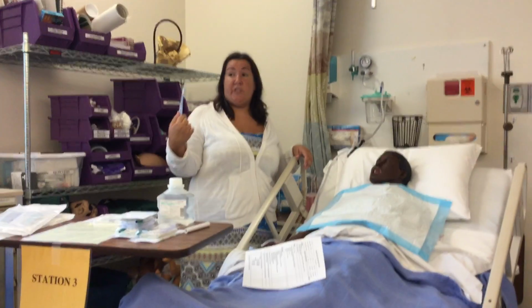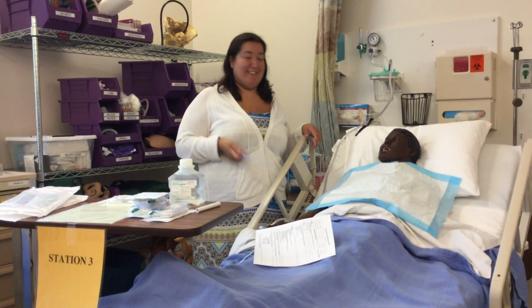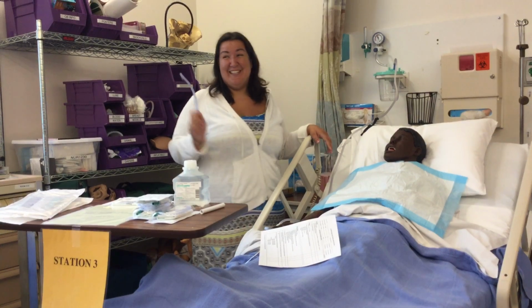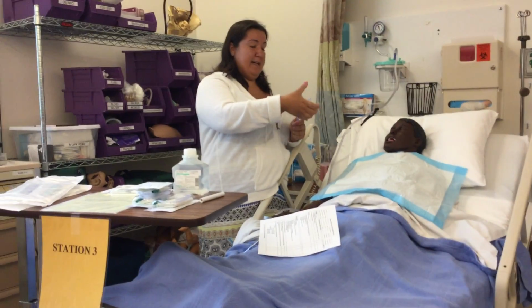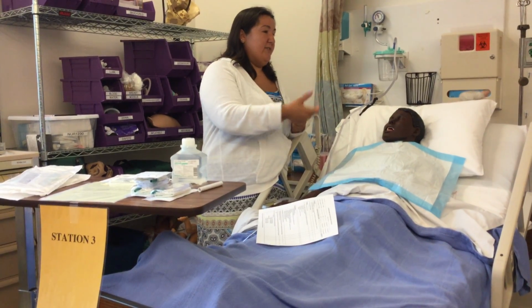Oral suctioning. So this is usually a suction in their mouth. You should never put this into a trach or anywhere else. A student said, "Oh yeah, we've seen them use that in people's trachs." No, never. That just horrified me. No, this just goes in their mouth. It's not sterile, because is your mouth sterile? No. And some places actually have nice ones now. I've seen where there's a cover that draws back and then comes back forward. So it keeps it a little cleaner.